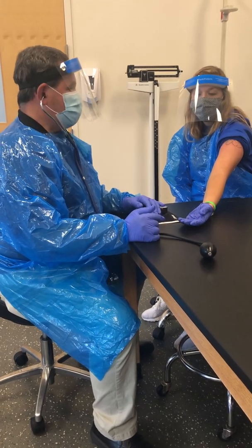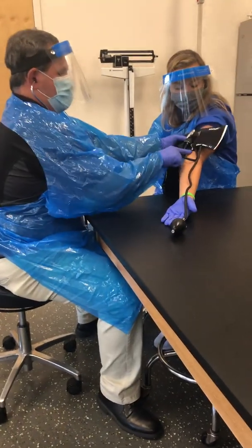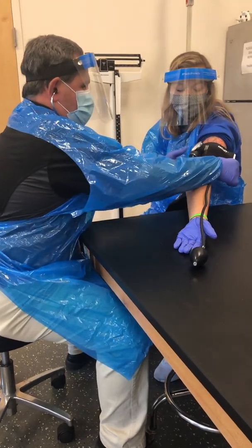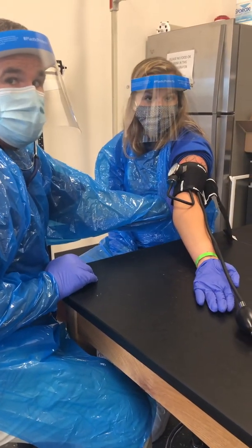The first thing we need to do is to make sure that we have the correct cuff. So with this cuff, I'm going to place the arterial line directly over the brachial artery. At this point in time, I'm wrapping the cuff around the upper arm, and if you can see here, she's within the index lines, which means we're using the appropriate cuff.